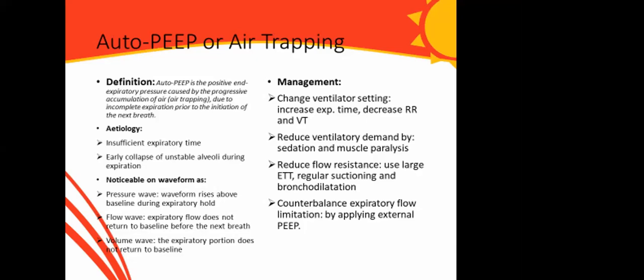Okay, no question. Let's quickly rattle through. It's almost an hour, so let's look at auto-PEEP, or air trapping. Auto-PEEP is defined as a positive end expiratory pressure caused by the progressive accumulation of air, due to incomplete expiration prior to the initiation of the next breath.